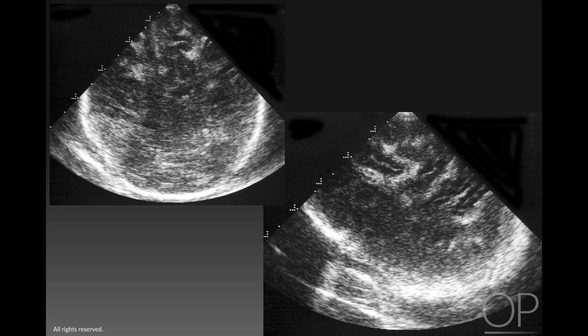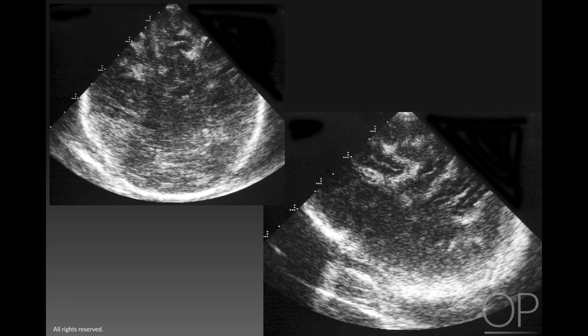This patient has had diffuse hypoxic ischemic injury and is full-term. We can see these focal bright bands of increased echogenicity surrounding the gyri in the central portions of the brain. These represent secondary hemorrhages in the subcortical U fibers, so secondary hemorrhage can be seen as brightly echogenic lesions occurring not as a result of a clotting abnormality, but as a result of underlying abnormal brain.